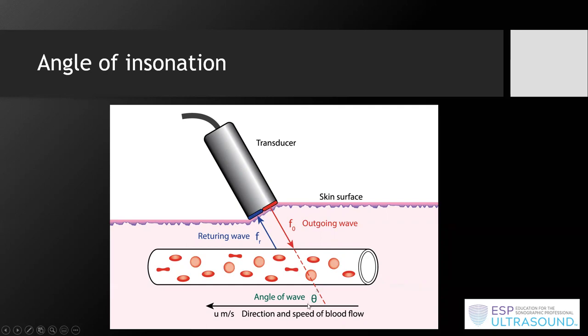If you knew the angle, you could account for that, right? Then you could tell the probe, okay, account for this difference in angle: I calculated a speed of X, but I know this is the angle, so you could do some fancy math, and I'll show you the equation in a second, to adjust for the actual speed. But you don't know that angle, right? This is why the best way to know that you're at the right angle is to be on the right axis. The more on axis you are, the more likely you are to be oriented towards the direct direction of the flow of blood, right?